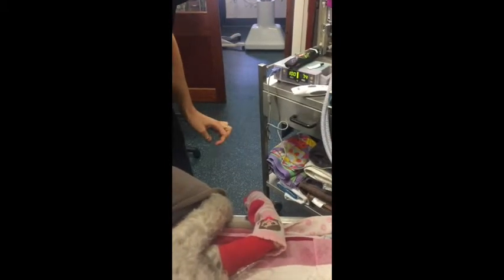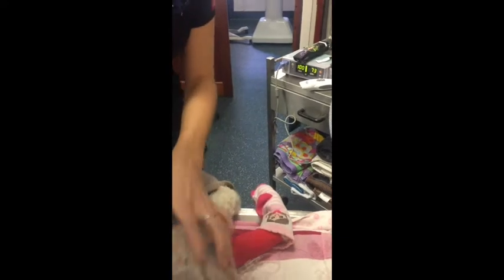This is why it is important to TPR the patient beforehand, to make sure that we know their ordinary heart rate prior to surgery, which provides us with a baseline on which to judge whether their heart rate has significantly increased or slowed. This patient's heart rate is nice and even and hasn't dropped significantly beyond his regular resting heart rate.